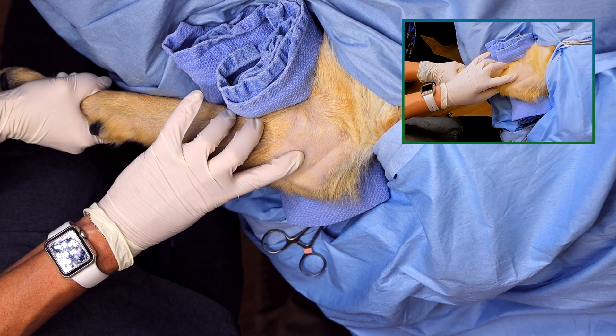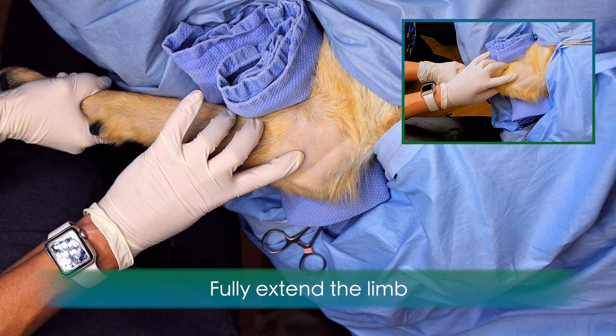To inject the canine elbow from the medial approach, the patient will lay in lateral recumbency with the affected elbow on the down side. You will want the patient to be close to the edge of the table nearest you, and you will want to fully extend the limb with the elbow at the edge of the table.